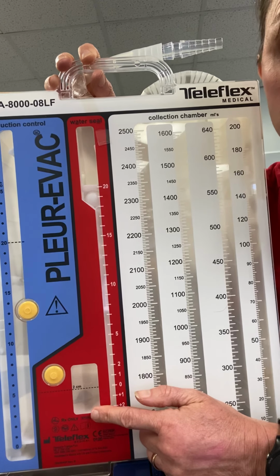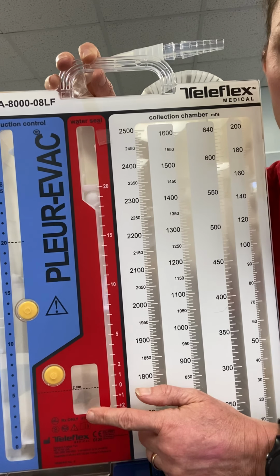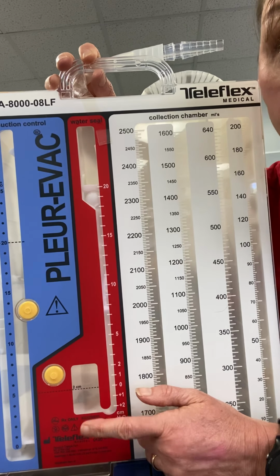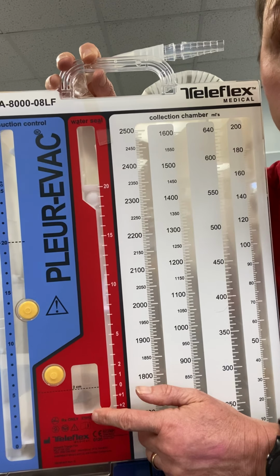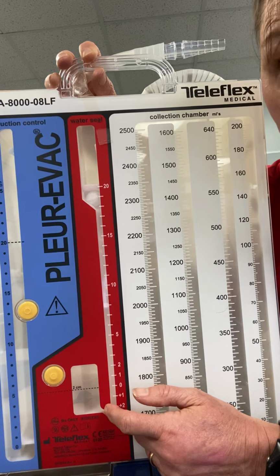You should not see constant bubbling in the water seal chamber. If your patient didn't have a pneumothorax, then you wouldn't expect an air leak. So if they develop an air leak, then that's a problem. You're going to have to assess your patient, call a rapid if you need to, and let the physician know.